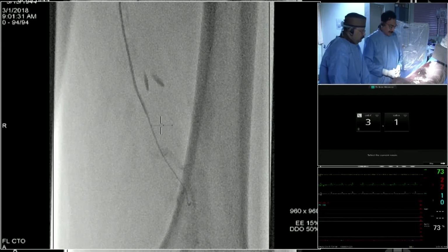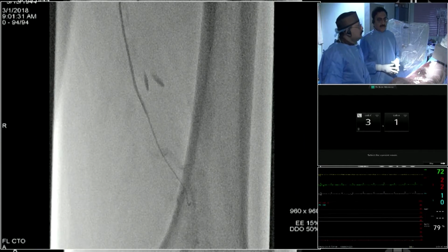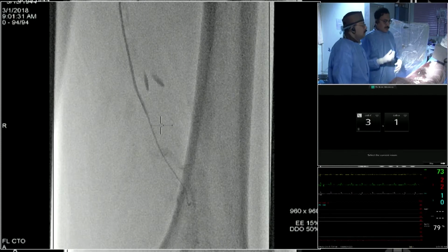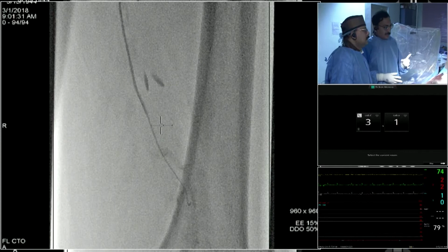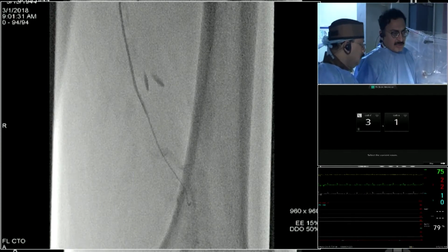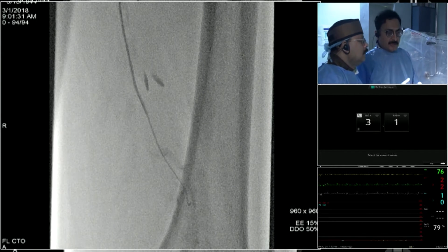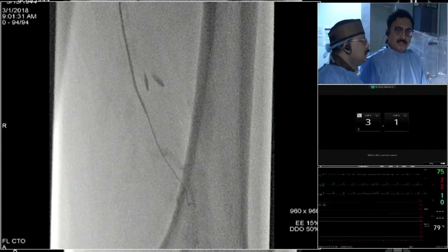I totally agree with that because, once we started, as you saw in the CT, we were not anticipating this, because there were just focal stenoses in the mid segment. True. But now that we know it's a very long segment, we don't want to turn him around and do a popliteal puncture and go retrograde. But I am very sure, because I am getting flow, that there is a communication between the false and the true lumen. It's only a matter of time before I find the true lumen and get back much above the knee joint, maybe just near the adductor canal.